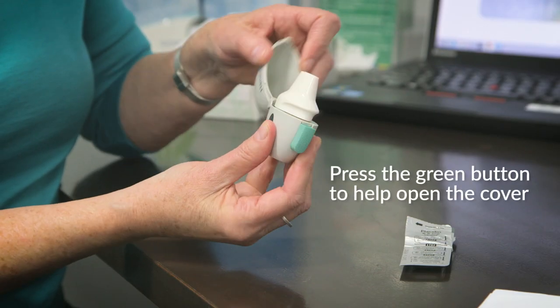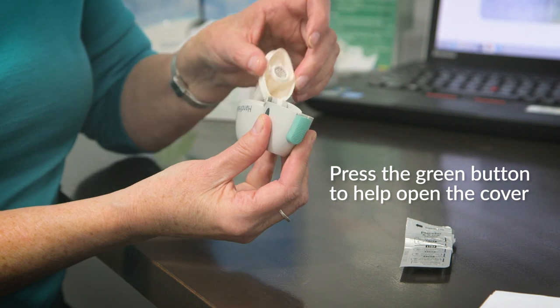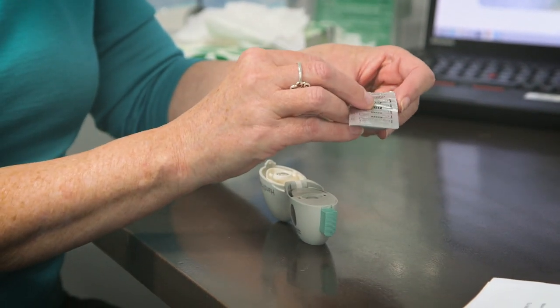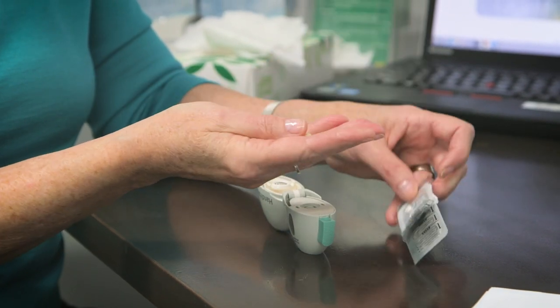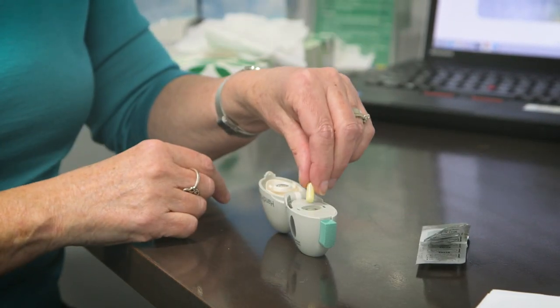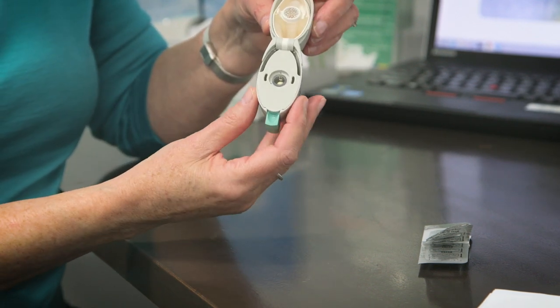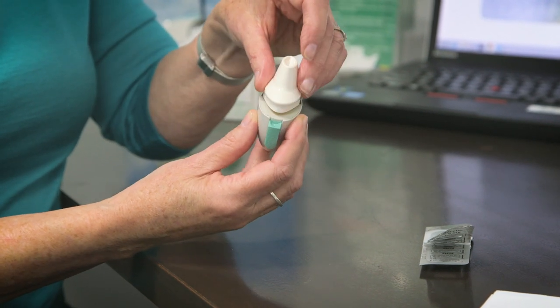Open the cover and then the mouthpiece. Remove the capsule from the foil. Place the capsule in the hole. Close the mouthpiece with a click.